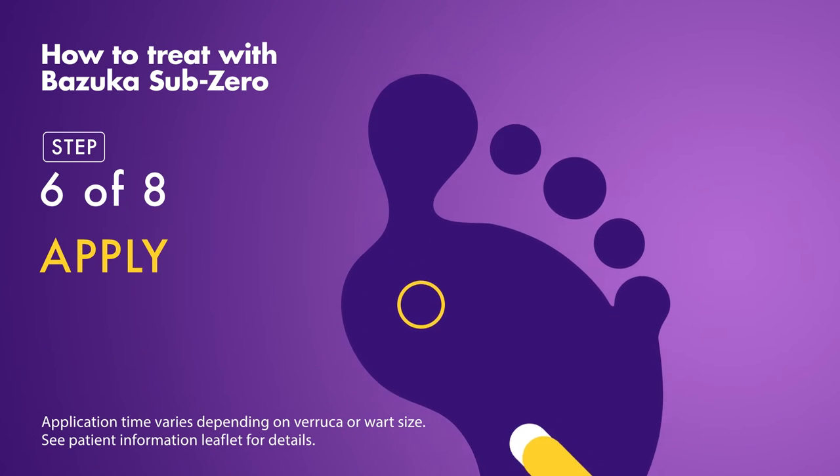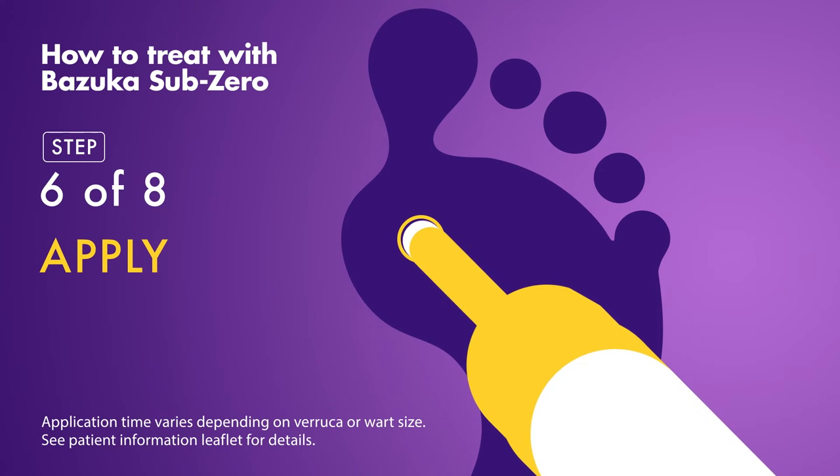Then immediately apply directly to the verruca or wart with a constant light pressure. Please refer to the patient information leaflet to find out how long you should apply Bazooka Sub-Zero, as this varies depending on the size and situation of your verruca or wart.